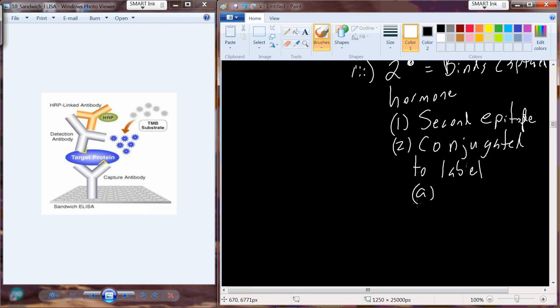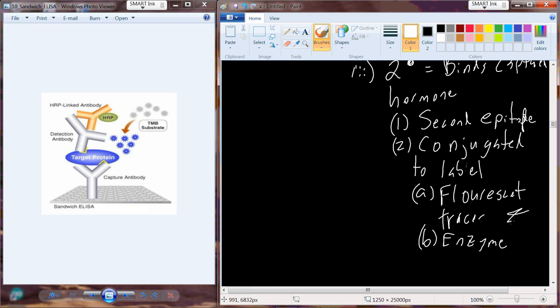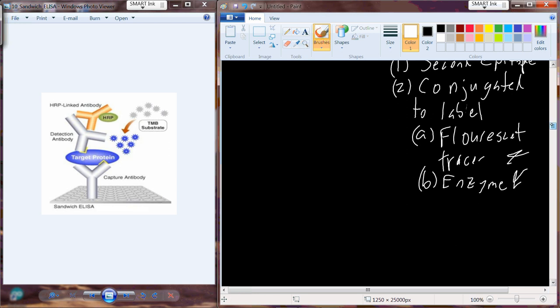So now your hormone is basically attached to a tracer that can fluoresce. So fluorescent tracer, or maybe it's an enzyme. And so we can stimulate that fluorescent tracer at the right wavelength and it'll give off light. We can detect that light. Or we give the enzyme the right substrates and it converts the substrate into product, and we can visually see or detect some sort of change in that product.